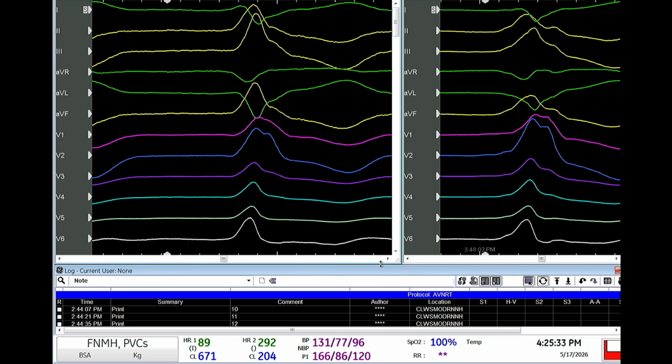And this is the type of case where I hope that by ablating in one area, we get rid of both. But you have to find that area, that zip code that I call it, okay? So in the history, you have two prior endocardial ablations, and particularly one endocardial ablation on the LVOT with a powerful catheter that suppressed the PVC and it came back. So either if there is a prior case or not, there is a workflow.